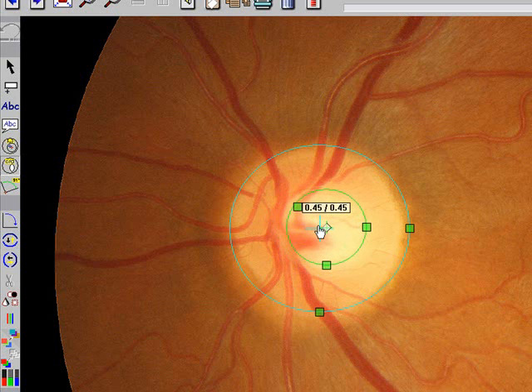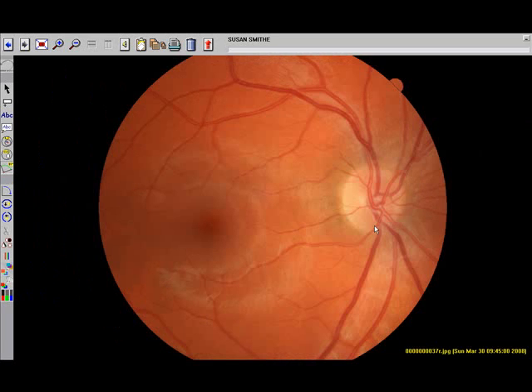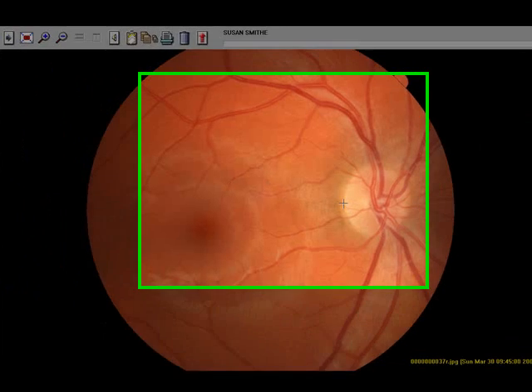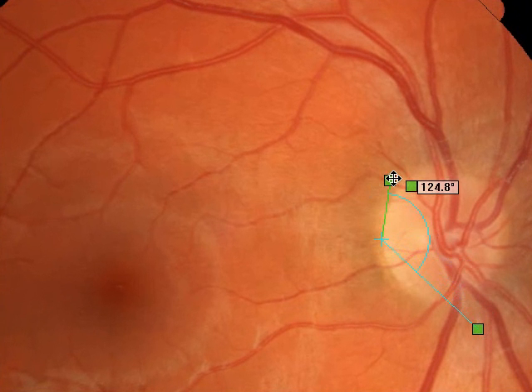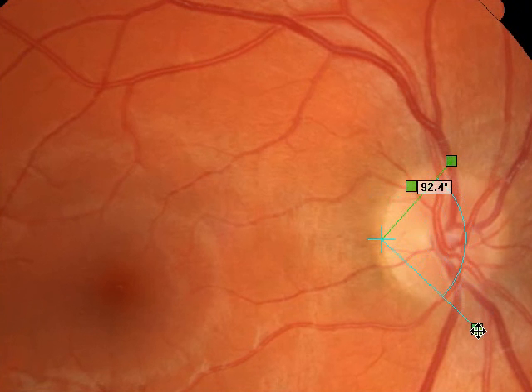To measure a structure using the protractor tool, click on the protractor tool on the left and click adjacent to the structure you wish to measure. Pull the green boxes so the arc inside the protractor is coincident with the edge of the pathology or structure.